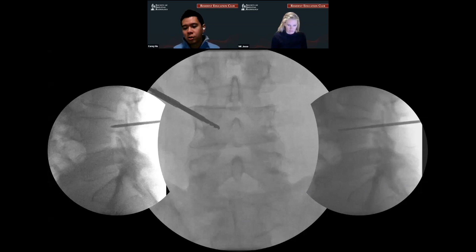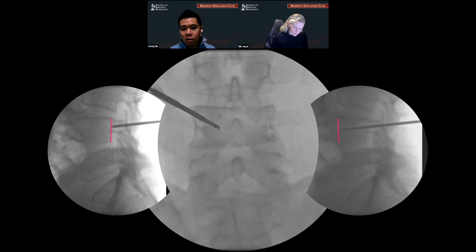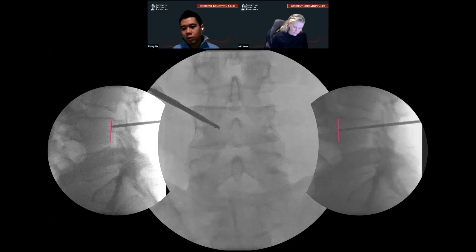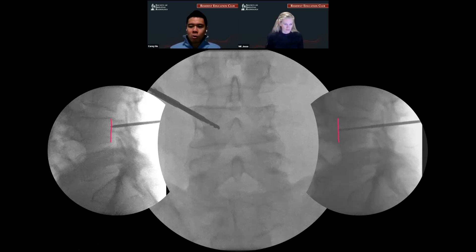Here are the intra-procedural images of this case. Each manufacturer has a way of showing mapping zones — this shows the posterior wall, which you want to be your mapping zone to keep away from the spinal canal. On the right image, we show a drill being placed in — these drills are color-coded. When you drill in all the way to where you want it to go, you get a color code that determines which size of the ablation probe you're going to use. The middle image shows that we want to have the probes close together in the midline because, fortuitously, the probes when placed together form the shape of a vertebral body.